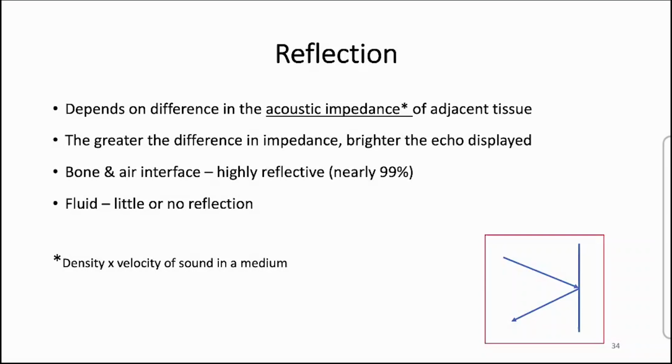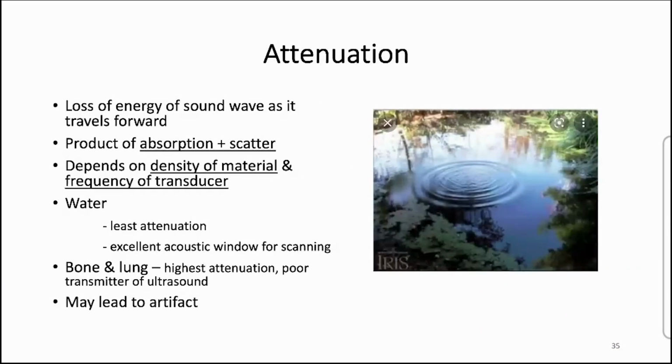What is attenuation? Just think about it. When we throw a stone on a pond, the wave moves further, and after a certain time, it fades away. Just like sound, when it goes through the body or tissue, after a certain time there is a loss of energy, and the sound wave fades down. It depends on the absorption of sound and scattering of the sound.